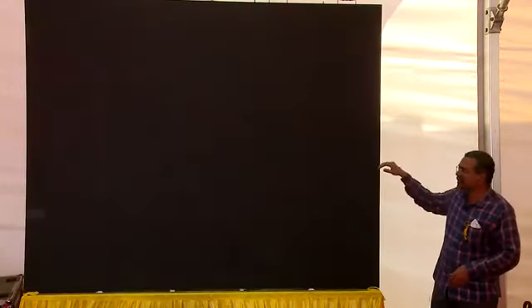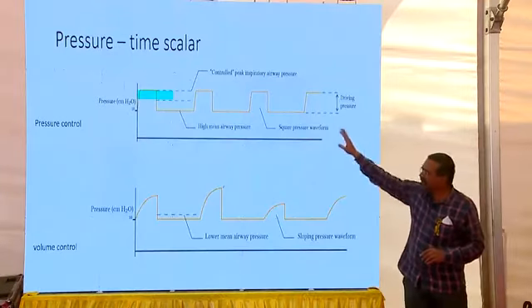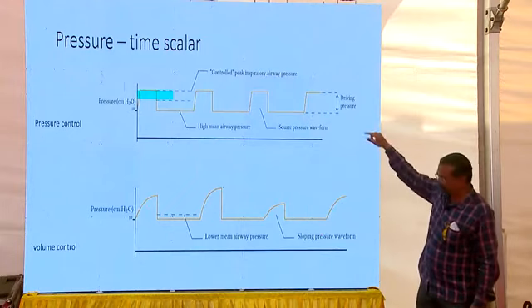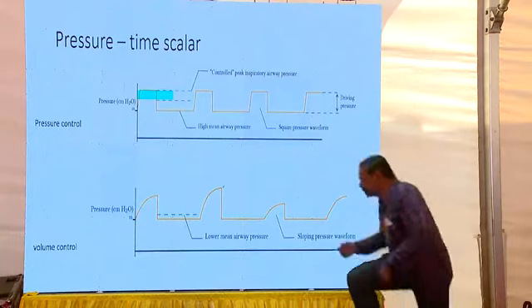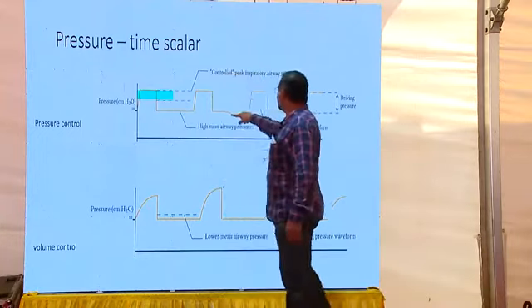So this is the graph. Only this graph will we use. In this graph, first is pressure and then there is volume. Now in pressure we can see the controlled PIP. In this particular thing we can see that this PIP is going up and down like this.